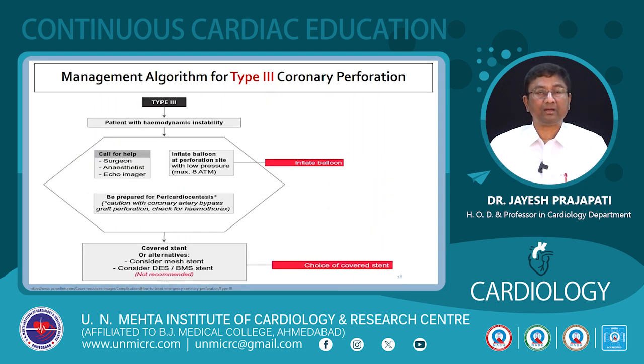Type 3 is the most dangerous kind of perforation. Always, once we notice the perforation, whether there is hemodynamic instability or stability, keep the balloon inflated either at the site of the lesion or proximal to the site, with a nominal pressure around 6 to 8 atmospheres, which is enough to occlude the flow, and we have to see whether flow is going on or not. We can keep the balloon inflated around 20 to 30 minutes. In between, at 5 to 10 minute intervals, we have to deflate the balloon sometimes to allow the flow to go. Sometimes the patient doesn't tolerate the ischemia, then we can keep a partially inflated balloon to reduce the flow. That also suffices till we can think of something else.